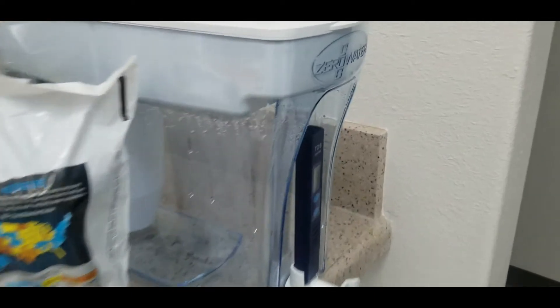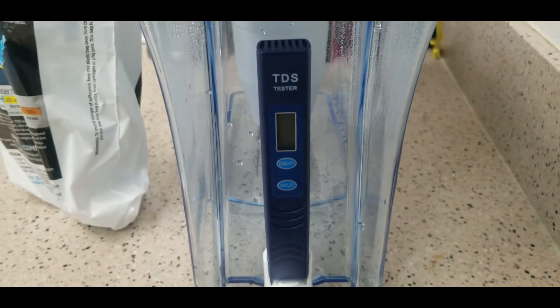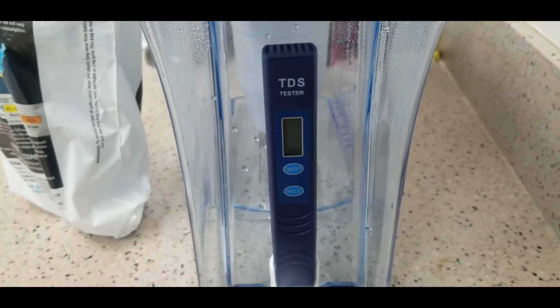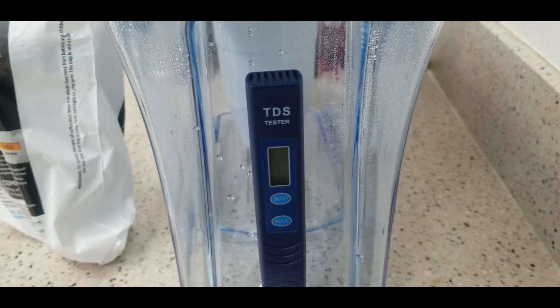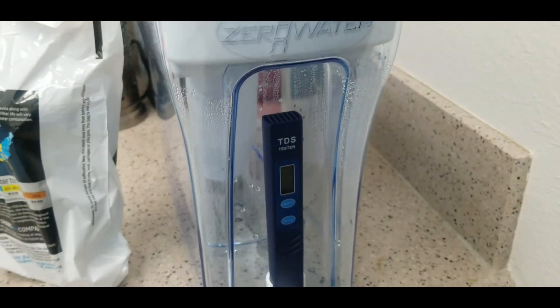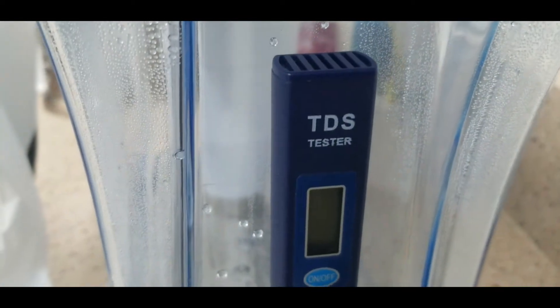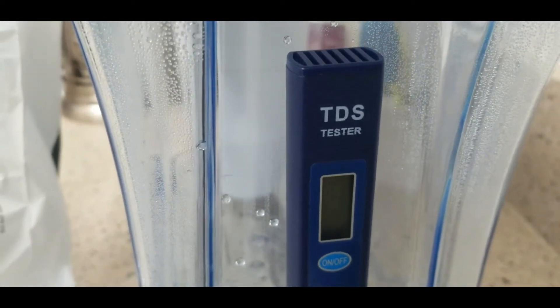The zero water filters come with a total dissolved solids (TDS) tester, which will give you a reading as to how many dissolved solids are in the water, so you know if it's equivalent to distilled water or not. You need to make sure it is actually a TDS rating of zero before you use it in your autoclave equipment.